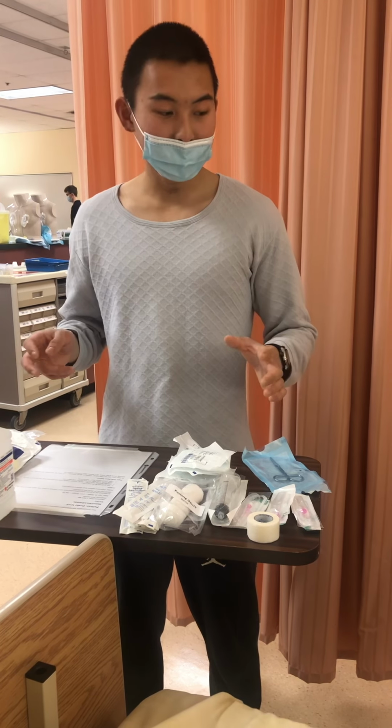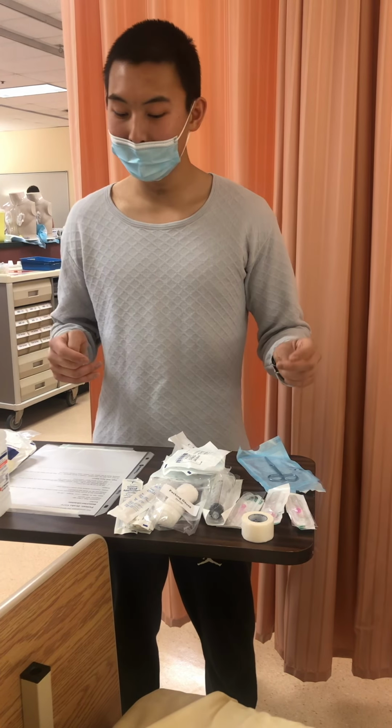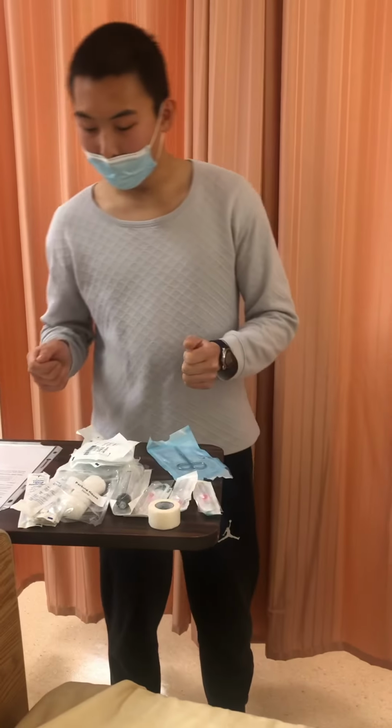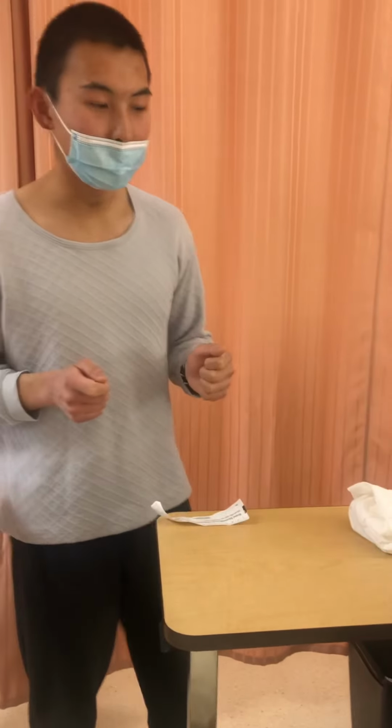So I've gathered all my supplies. I go into the patient's room and I make sure that the overbed table is clean, and I have my MAR with me. Hello sir, my name is Hongyang Lin and I am a student nurse. The reason I'm here is to do a complex wound care on your abdominal wound.